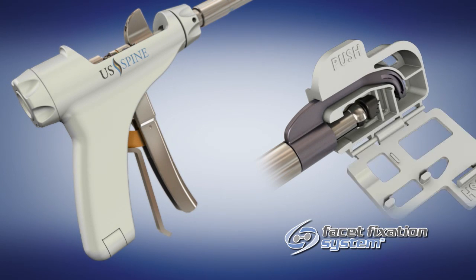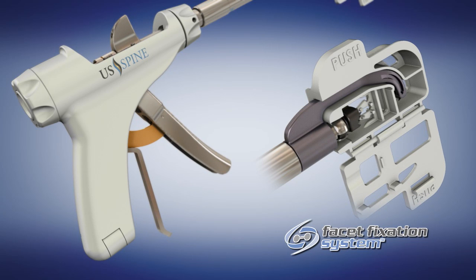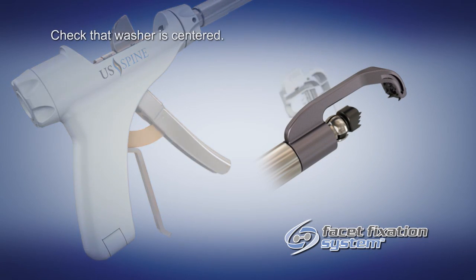Open the door of the cassette and release the trigger by pulling the release lever located just behind the trigger. The plastic cassette can be removed from the side and discarded.